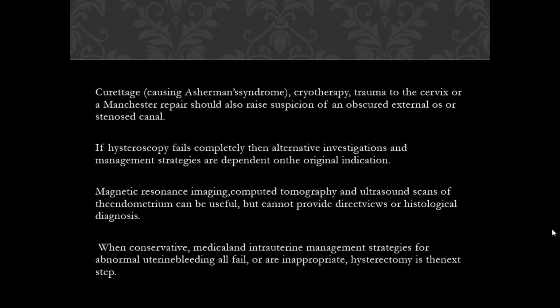Now the hysteroscopic sterilization as well is in practice. It's not common at all to be offered because of conditions such as escape of the metallic portion through to the intraperitoneal cavity, improper placement of the metallic part, and it needs a highly expert hysteroscopist to do it. So it's uncommon to be offered and uncommon to be asked in either part 2 exam or part 3 exam as well. That's it.